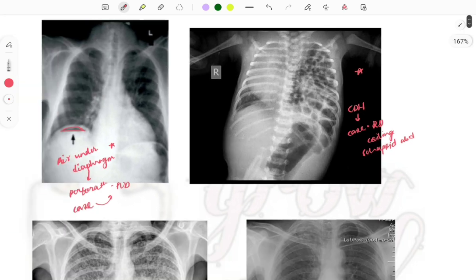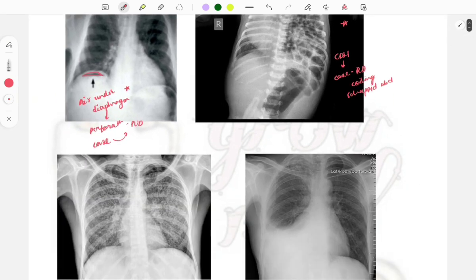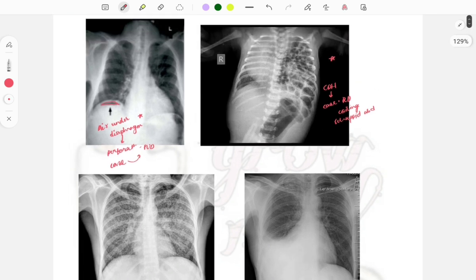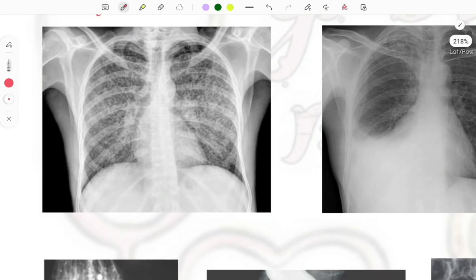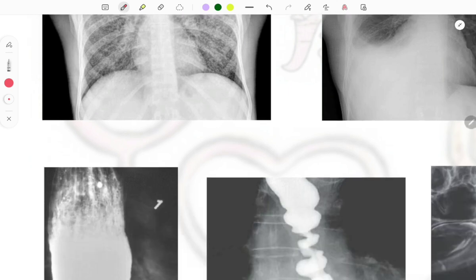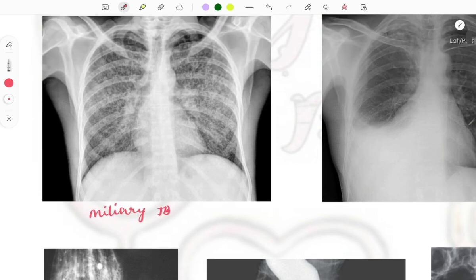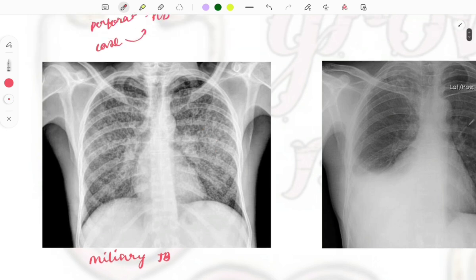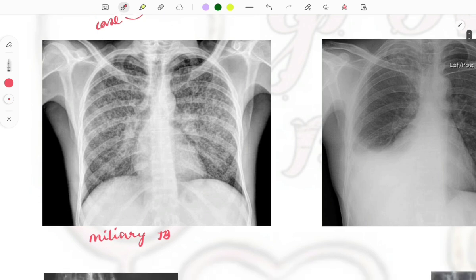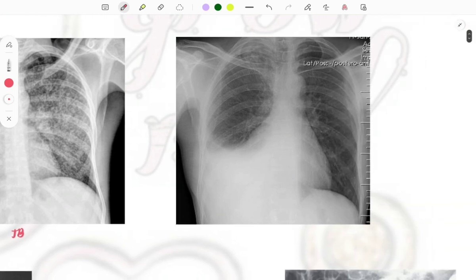I'm covering radiology along with related clinical topics from other subjects so you can revise everything in one go. Next is miliary TB — a chest X-ray showing TB widespread throughout the lungs, with multiple dots visible. If a patient presents with cough, night sweats, and sudden weight loss and this chest X-ray is given, the diagnosis is miliary TB.